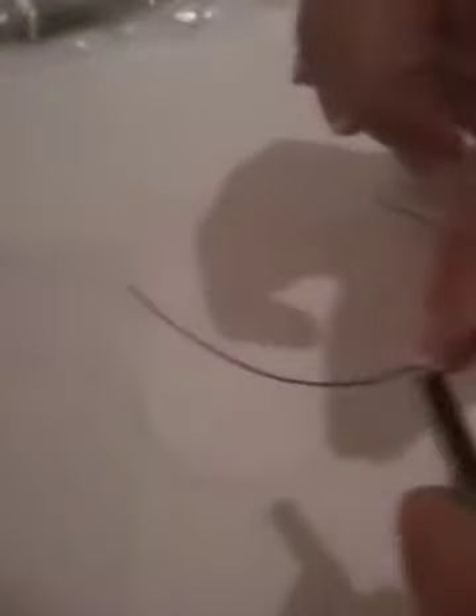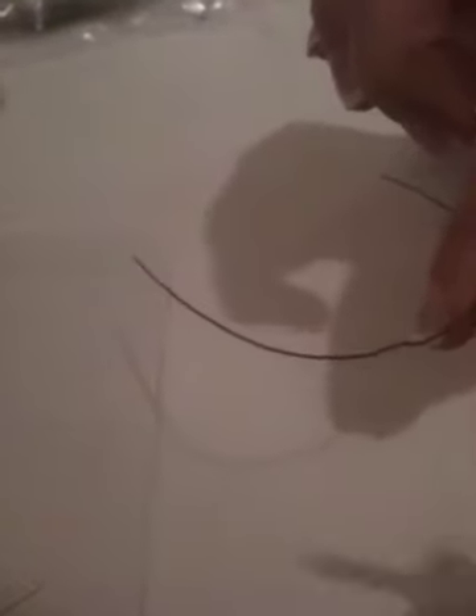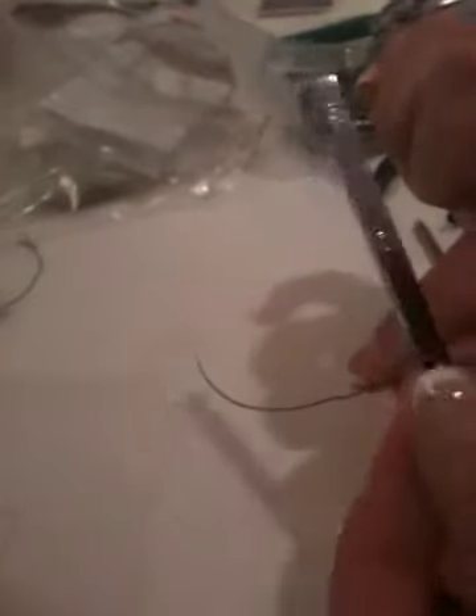We're using the same wire from the last exercise where we did first and second order bends for the lateral. Now we need to move the root of the lateral, which is too far lingual. This is the crown and this is the root — we want to bring the root forward buccally, so we need to apply a torque to the root.